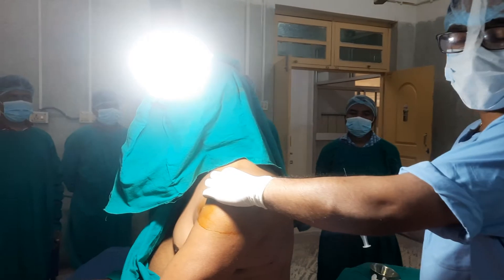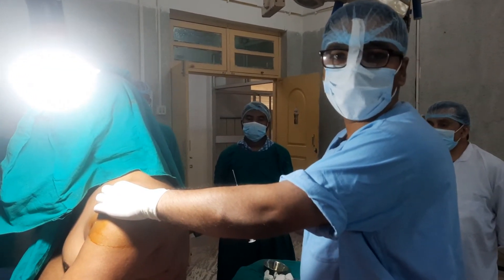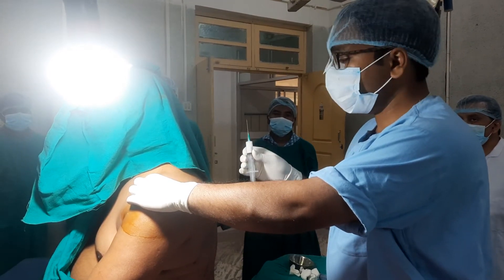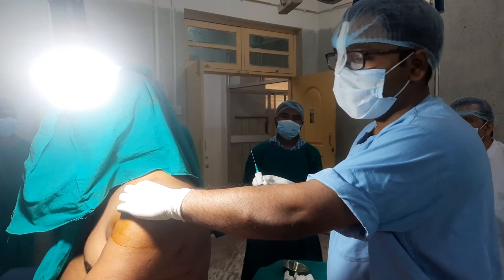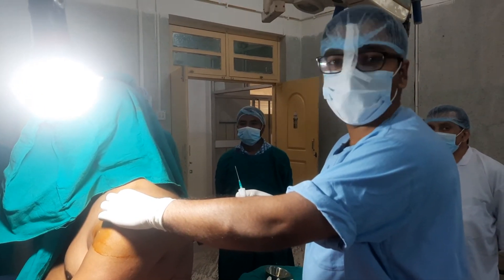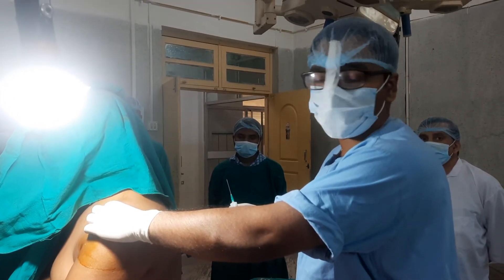My cocktail today is 3 to 4 ml of 2% lignocaine along with 40 mg of Depo-Medrol, mixed in a 10 cc syringe. The skin has been prepared with 3 layers of betadine followed by spirit and antiseptic draping.